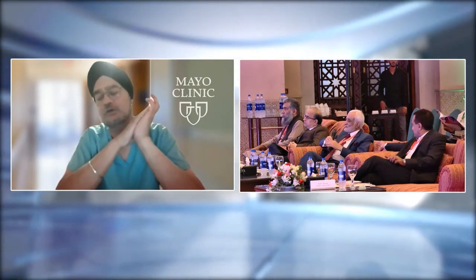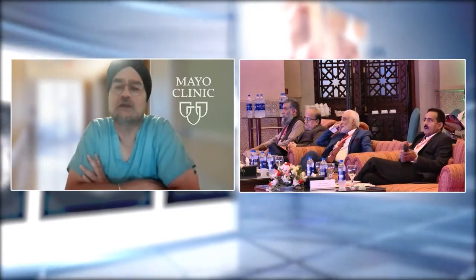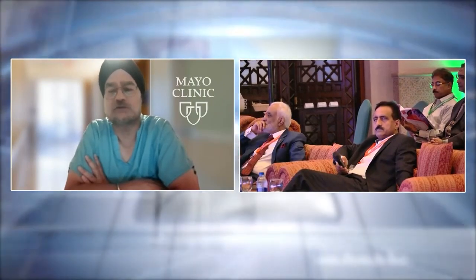Thank you for your question. My general advice is for each center to pick and master one type of valve. For example, at our center, we use the balloon expandable valve in probably 80 or 90% of our cases. And we are confident that we can get it in to our patients almost always, including using alternate access of various types if we need to.